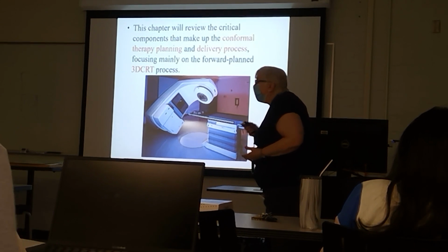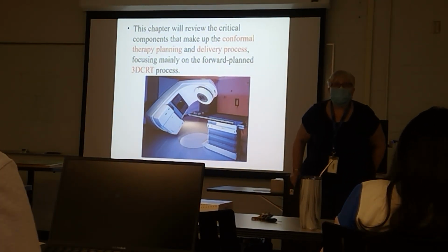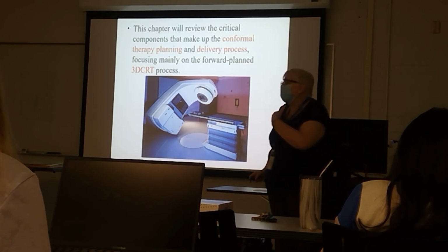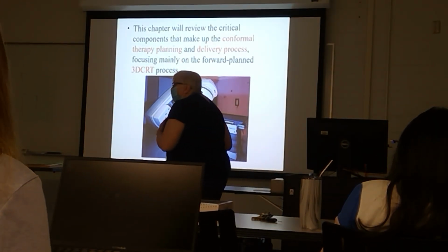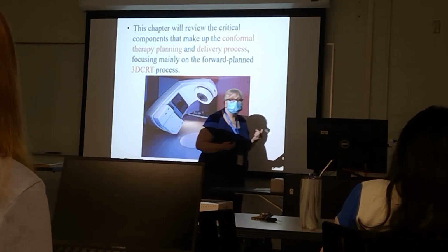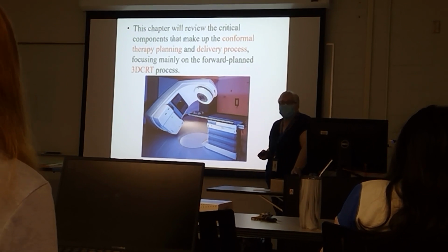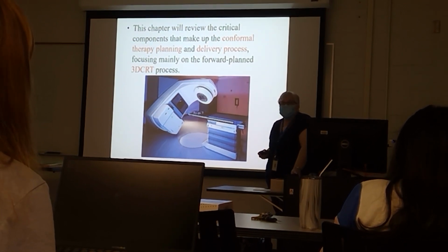So what does the back pointer do? Think about it. You have a front pointer, which is what? The front pointer is the center of the crosshairs.